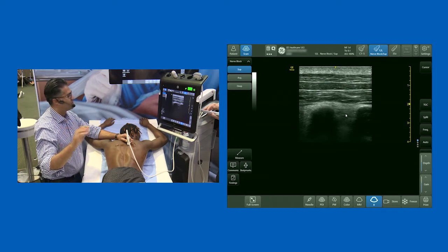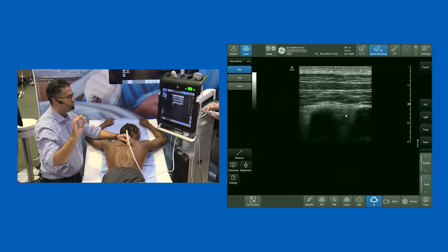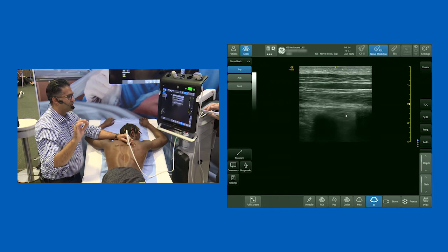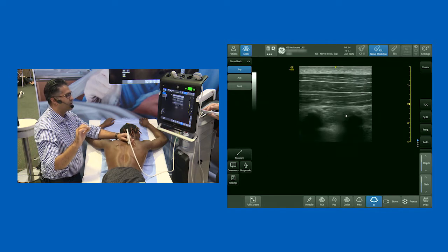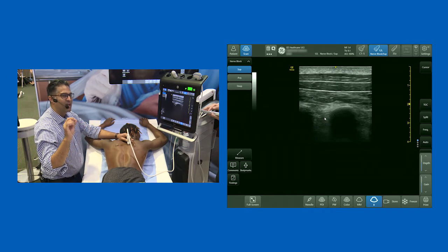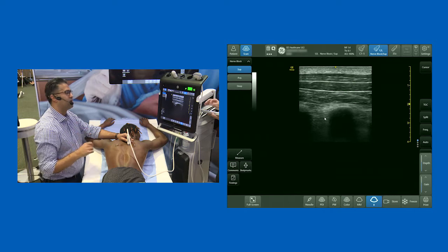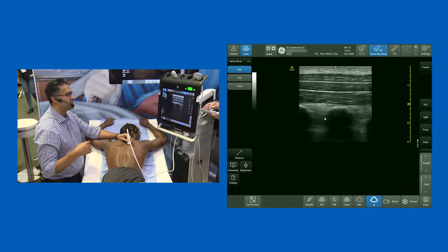That's all you're aiming to do — you don't want to go deeper than that. You inject four to five mils of local anaesthetic and then repeat it at a level above. The whole idea is to get close to the paravertebral space but without actually getting there.